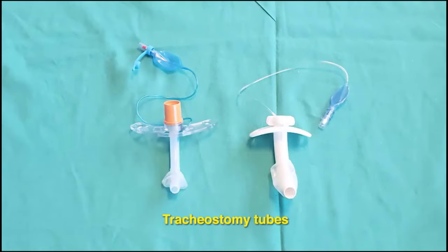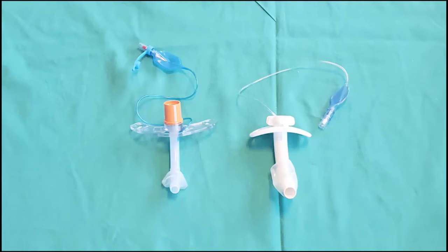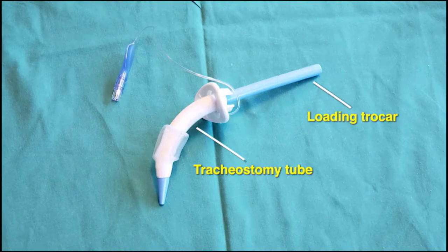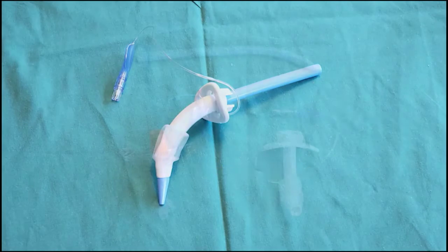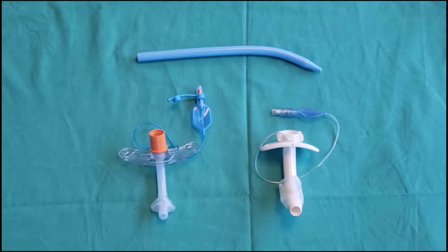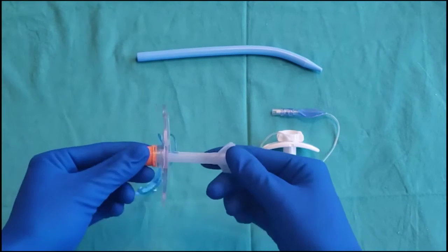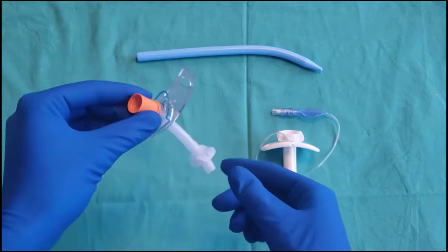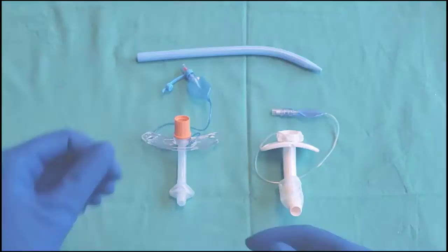The size of the tracheostomy tube selected should be appropriate for the patient. Percutaneous tracheostomy kits are designed to be used with a specialized tracheostomy tube that loads onto a dilator. In practice, however, any tracheostomy tube can be inserted in a percutaneous fashion. We use a thin, flexible tracheostomy tube because it maximizes the airway diameter while minimizing pressure on the tracheal wall.